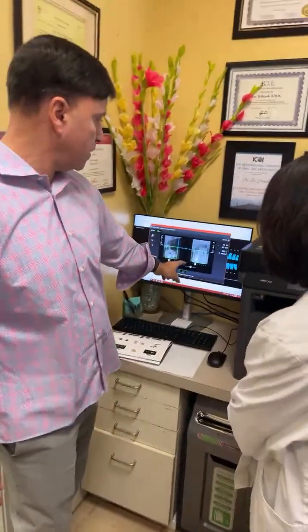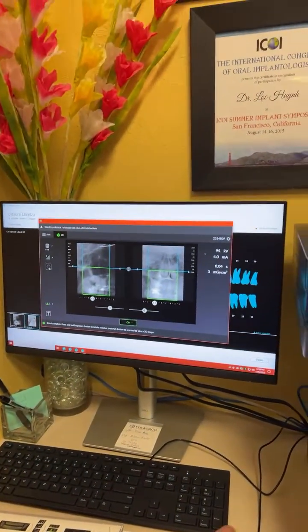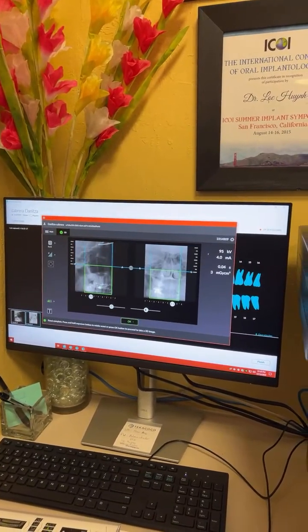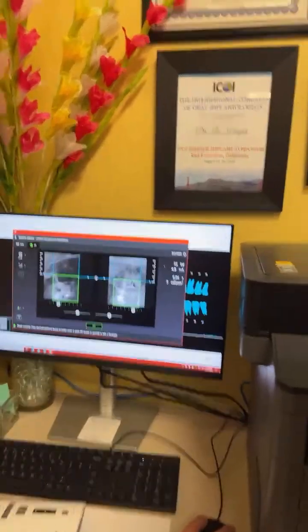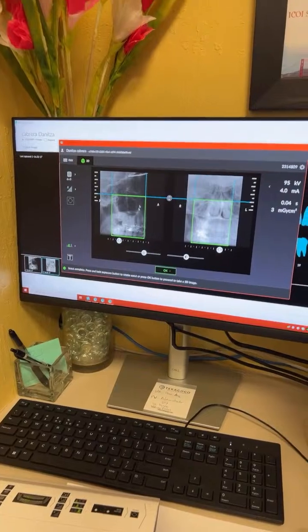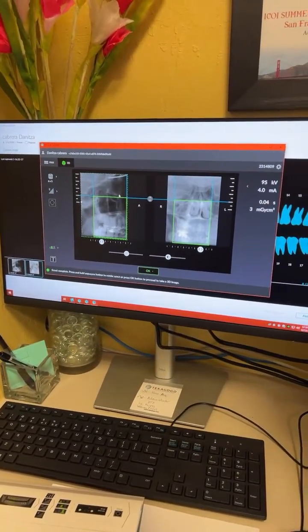There's her lateral and frontal. There's your preview. This is where you can say, I can clean this up. Maybe I want to focus a little more posterior, or maybe I want more anterior. Maybe I need more height. Can I do that? Yep. So I want it down more. How do I move it down more? You can't go down. Nope, that is the limit on that.